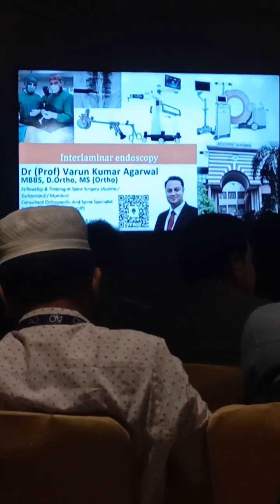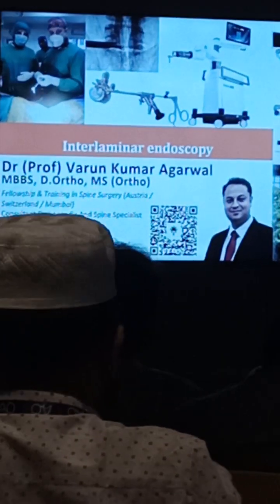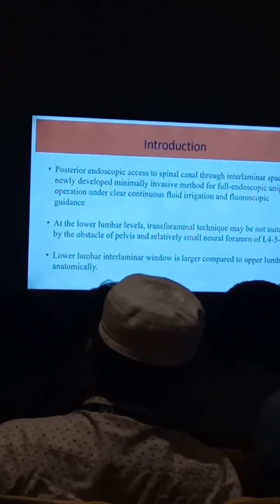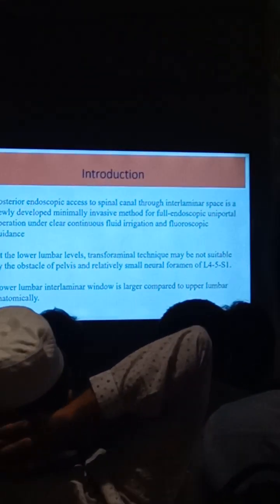than the tube, and we are using it freehand instead of anchoring it to the table with a tube like a tube retractor. So it is a newly developed technique as compared to the transforaminal, and we use a clear continuous fluid irrigation and fluoroscopic guidance. At the lower lumbar levels, transforaminal technique may not be suitable, as we all know.